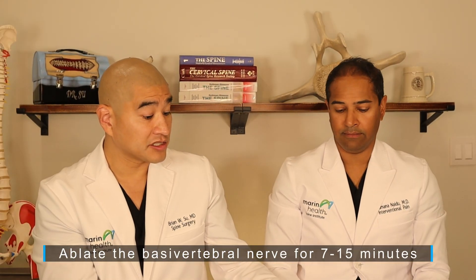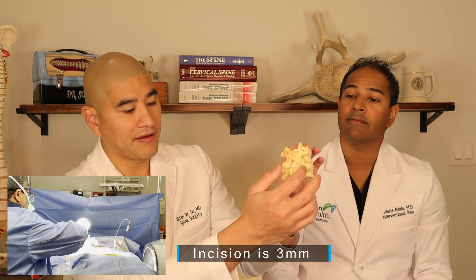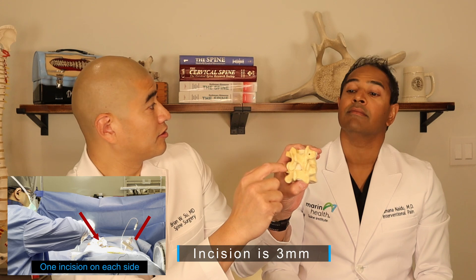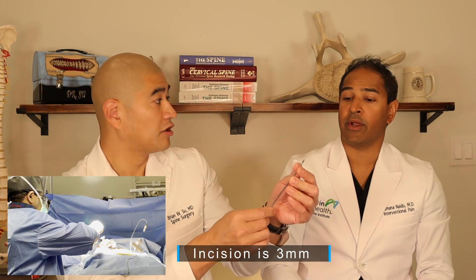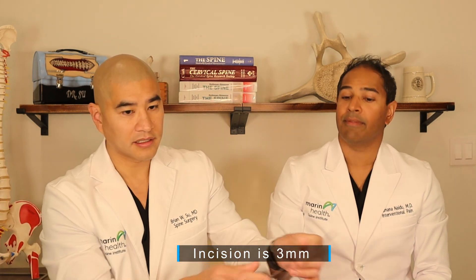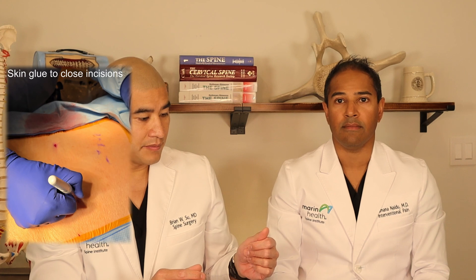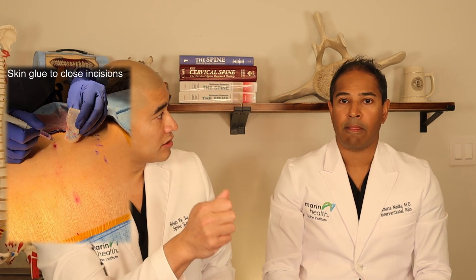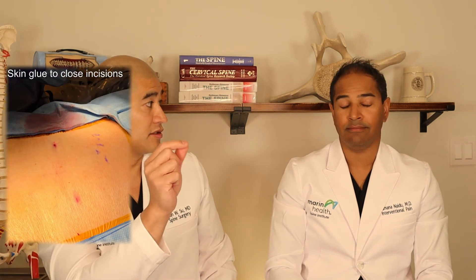As for the incisions — if this is the back, you're going to have a tiny poke hole here and a tiny poke hole there. The incisions are just a few millimeters — no bigger than the trocar itself. Once you finish the ablation, you just use a little bit of skin glue over the hole to close it.